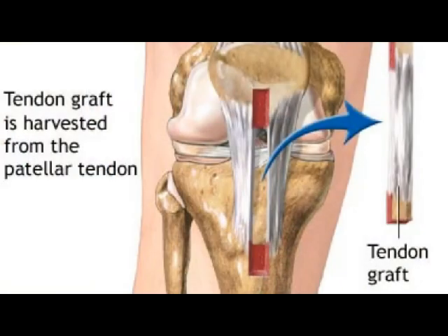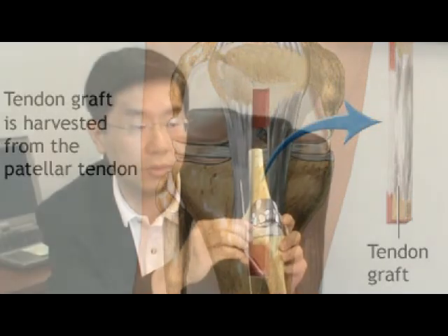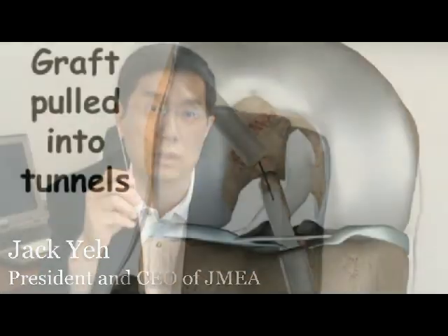The graft can be either an allograft, which is from a cadaver, or an autograft, which is out of the patient's own tendon or ligament. Basically, this guide wire is then used to pull the tendon through the two tunnels.